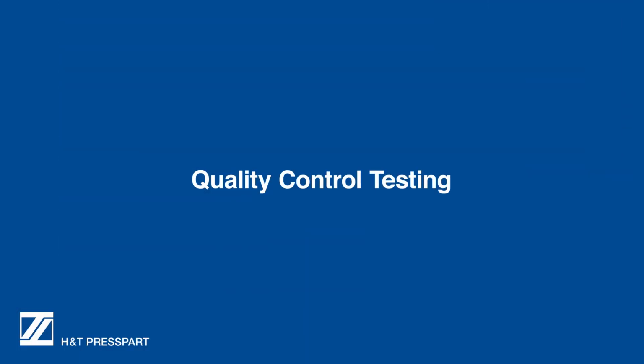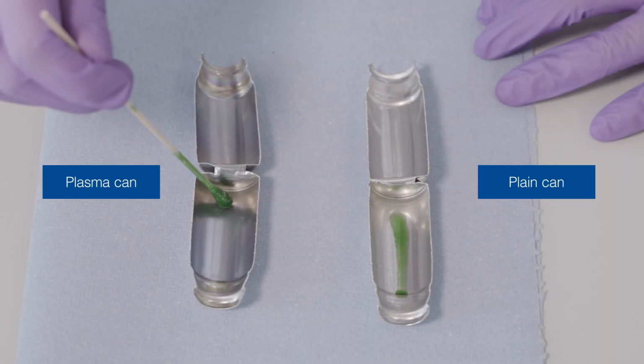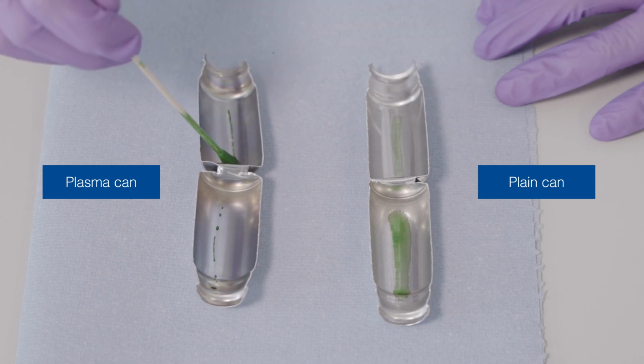Numerous quality control tests are performed on our plasma cans. The first being a dyne test, which quantifies the surface energy of the can. The dyne ink is applied and the plain aluminium can wets and the plasma can beads, showing low surface energy.